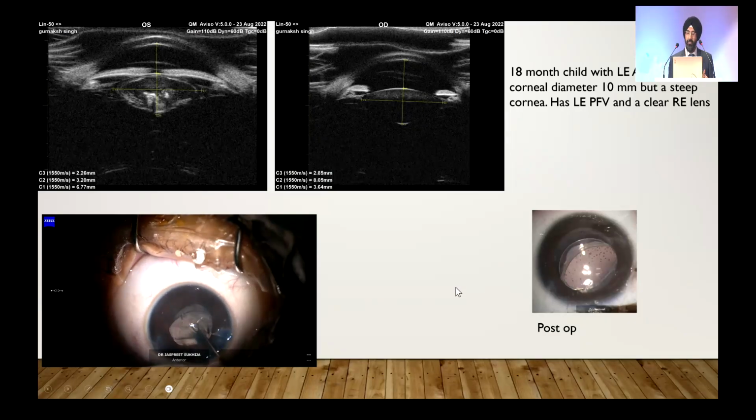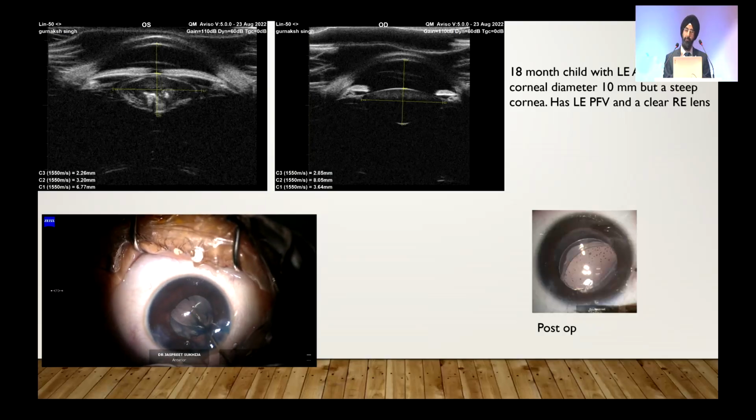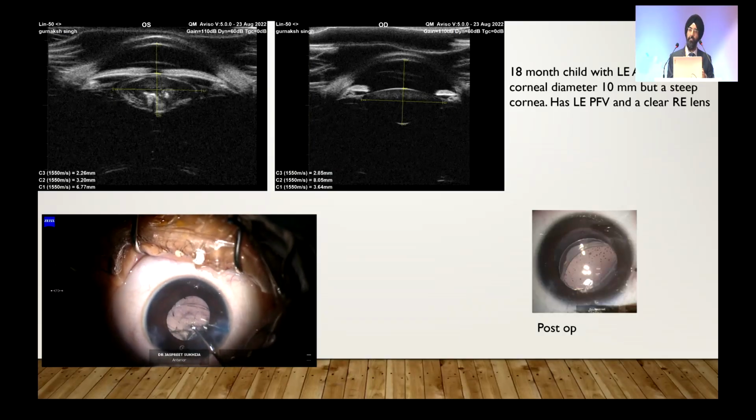Well, what you can do is something like this. Because it's unilateral, and in Indian conditions the contact lenses are a big issue, what you can do is something known as a bicapsular capture. So you have a good sulcus. So you put your haptics in the sulcus, what we've done here, and you get the optic behind the posterior capsule.